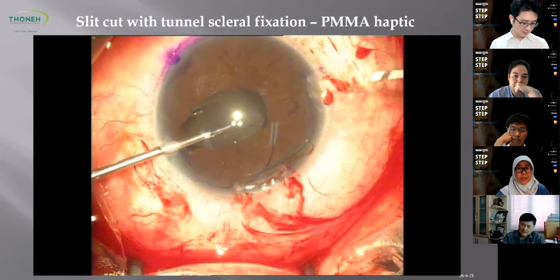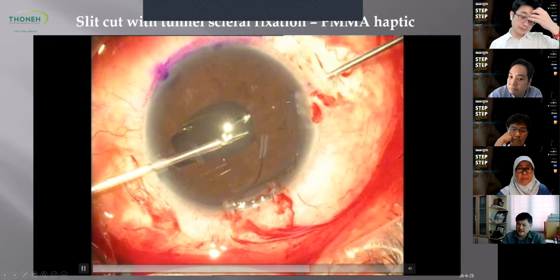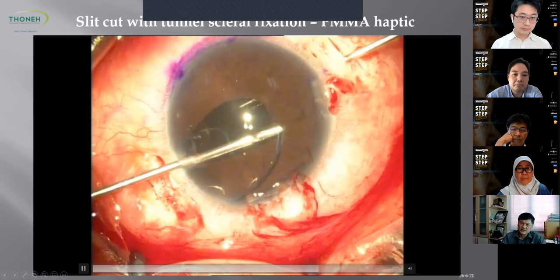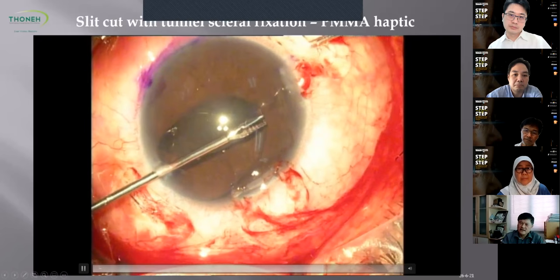A similar step is performed to capture the other haptic on the other side. So in a handshake manner, one microforceps captures the haptic, the other one tries to capture the tip to fit it into the other microforceps, and then you pull it out gradually in a controlled fashion.